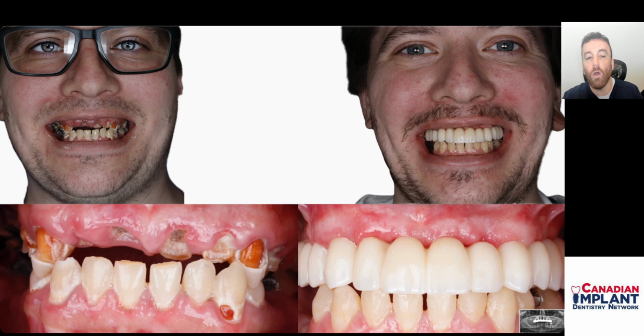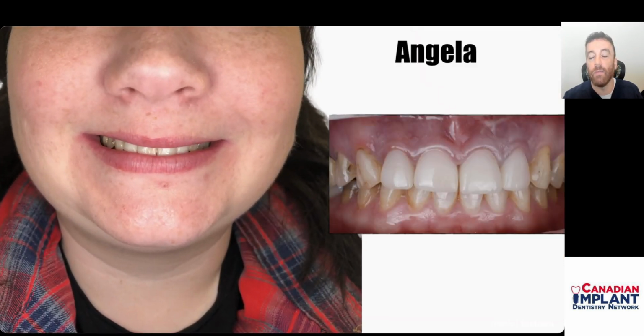We didn't have to go cut away all that bone. You can see the change in his face and his eyes simply from having that rejuvenated smile and given a second chance again at having confidence back in his life. The last case I want to discuss with you is Angela. So Angela is in a similar situation as Mark, however she has a low smile line.